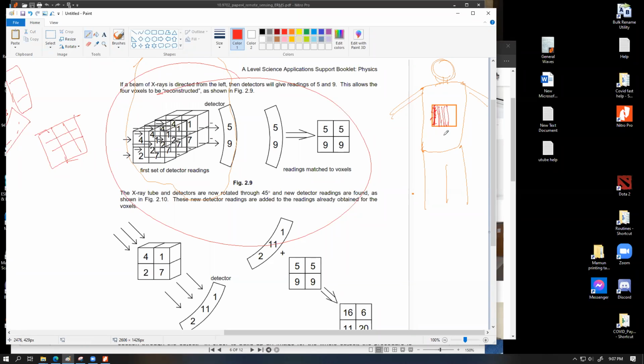horizontal length of this CT scan that you're trying to achieve, let's say it is 10 centimeters. The CT scanner we are working with, let's say its voxel dimension is 0.1 centimeter. So it can detect the value of a 0.1 centimeter physical space. So 0.1 by 0.1 by 0.1, which means what? Along this line, how many voxels in total can you have? It's possible to have 100 voxels, right?